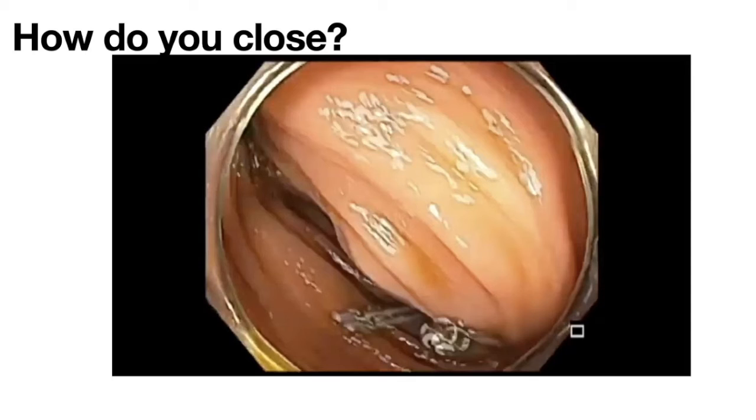In the beginning, when we don't know a patient very well, at the index colonoscopy, when we see a lot of lesions, we still prefer to use pancolonic chromoendoscopy with indigo carmine to maximize the output and better phenotype the patient, because this will have repercussions for his referral to the genetic department. If he doesn't have enough lesions, we will say, well, we will wait another 2 years. But if he has, let's say, 9-11 lesions, we will refer the patient to the genetic department and they will do additional molecular analysis. Okay. I really appreciate your input. I just briefly read that paper, the one that you're suggesting.